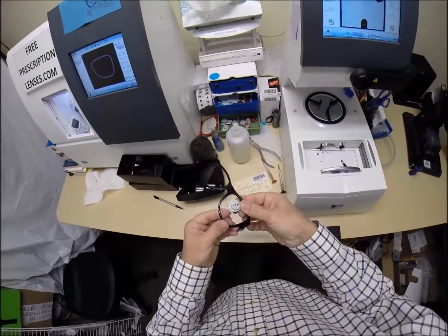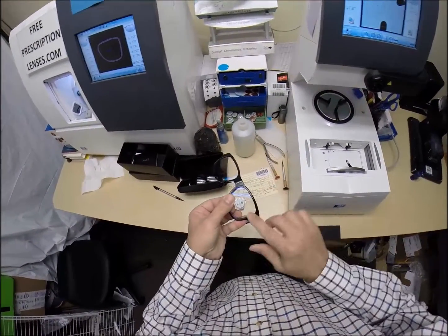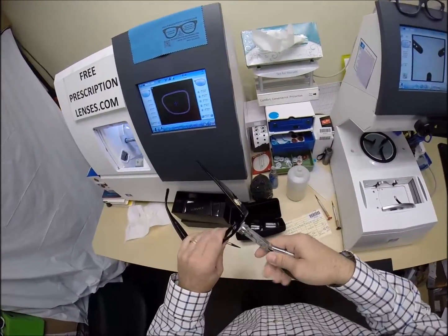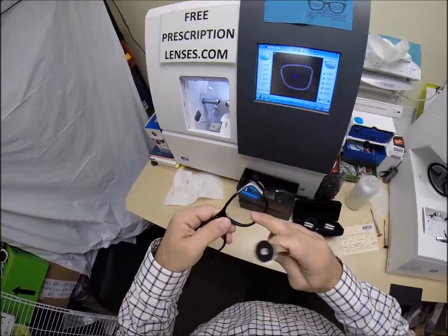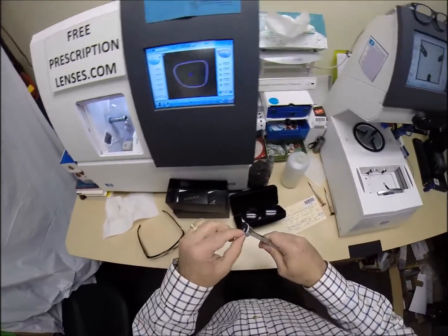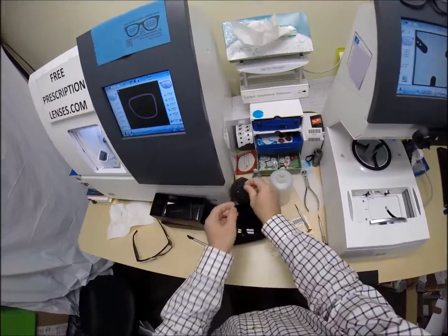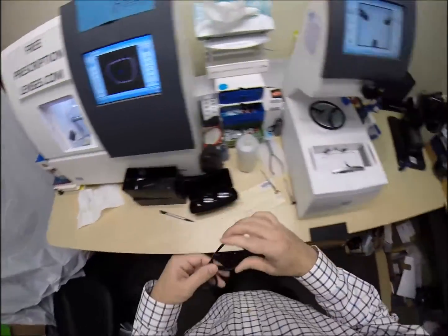So, I'm going to go ahead and tuck the lens in at the outside corner first using my thumbs. Press down, it snaps in. Look at that, the block's already coming off because of the hydrophobic coating on the Crizal Sapphire, which is nice because if it's ever raining, the water beads right off the lens. This is the nicest of all the Crizal coatings.